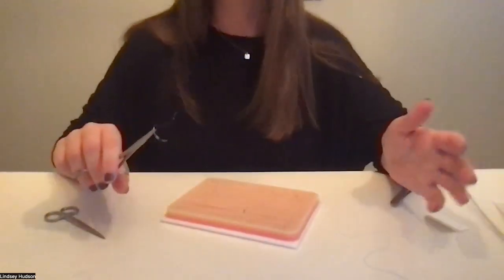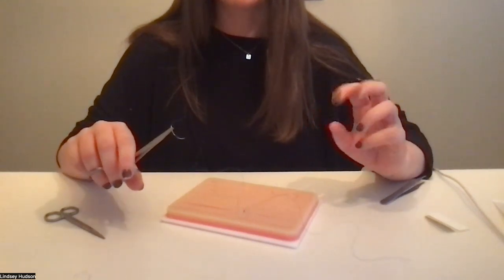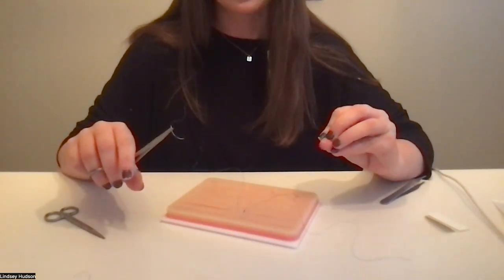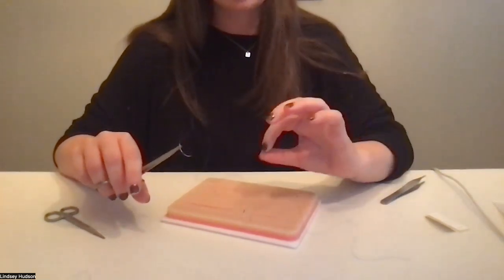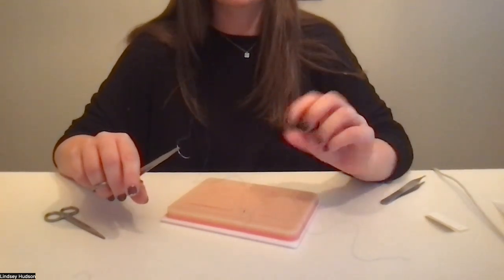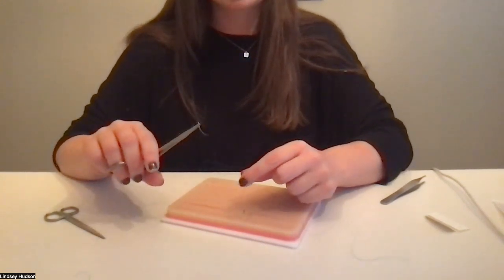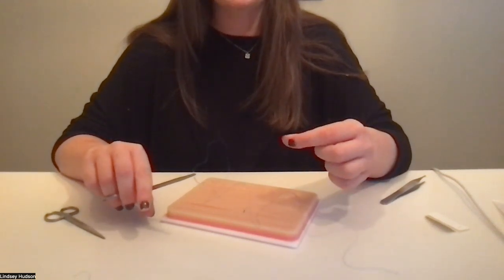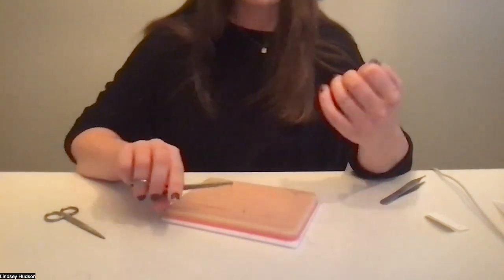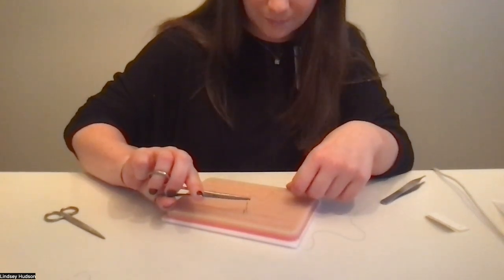It really also does depend on the wound and how deep it is, and how much pulling the sutures will do. You don't want to do them too close together or too far apart, because you do want that skin approximated throughout, but you don't want it so close and so tight that it's going to pull on the skin and cause pain. And also you want to try and reduce any kind of scarring if you can.